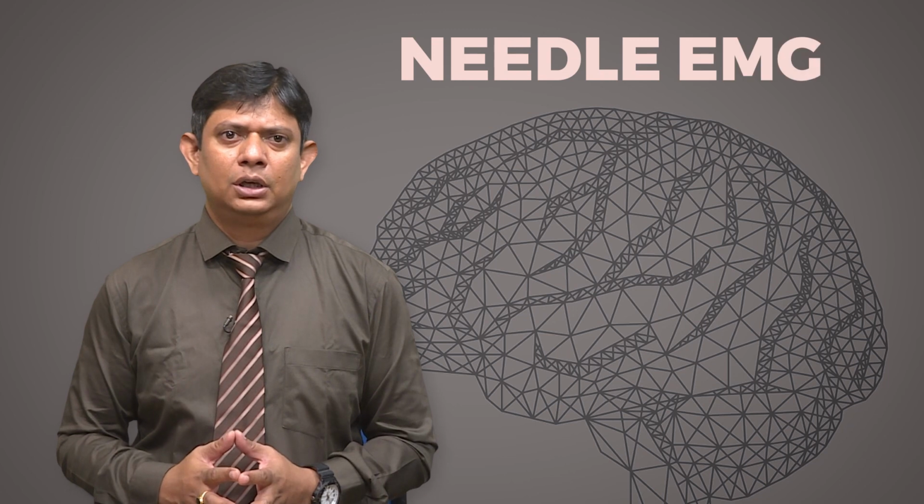The last category of EMG is the needle EMG. For needle EMG, the electrodes are inserted into the muscles. The electrodes are mostly used to evaluate motor unit function. Single motor unit information can be recorded rather easily with needle EMG because the distance between the active muscle fiber and the needle electrode is small.